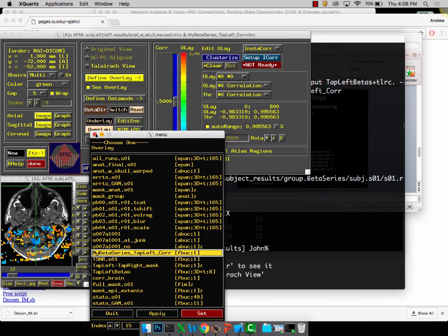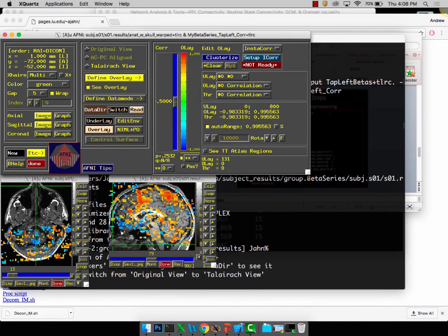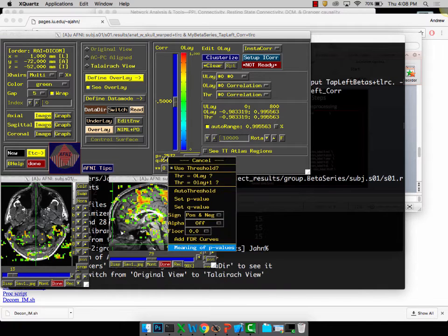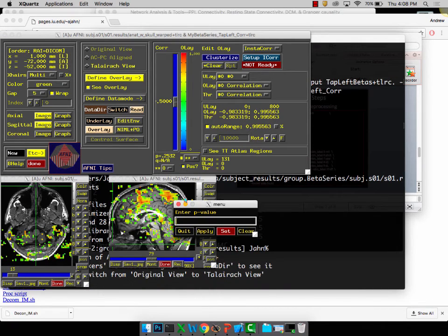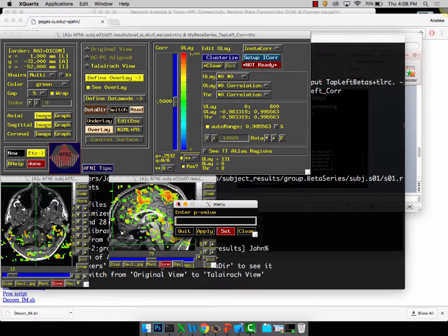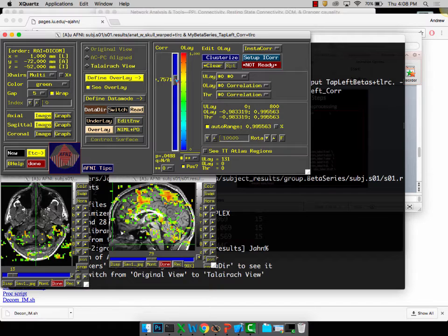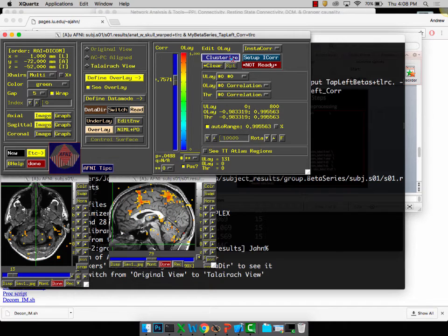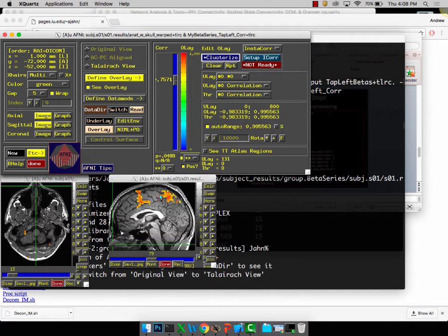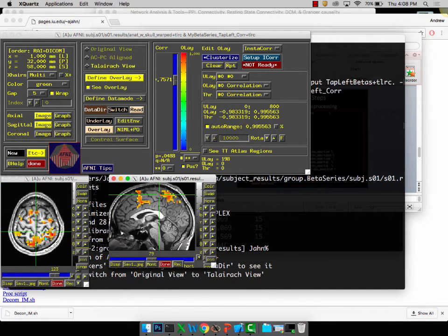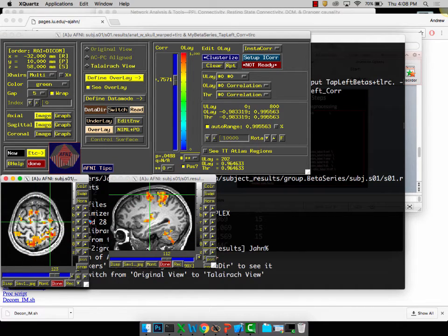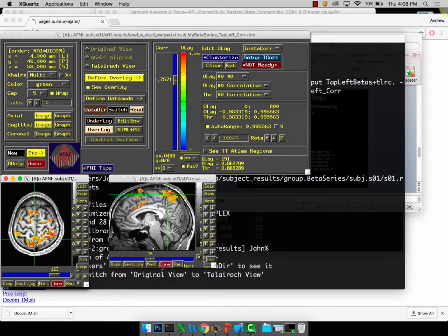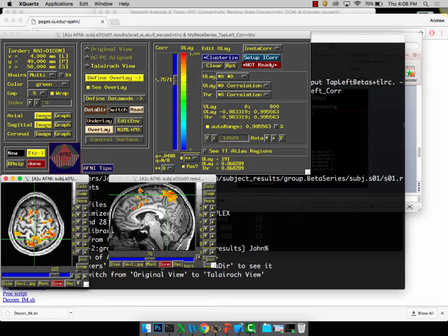If we take a look at this, remember for the univariate analysis it was pretty much just the right motor cortex that was getting activated. In this case, we want to know if there are any significant correlations between that and other parts of the brain based on these beta series. If I look at my beta series tap left correlation, here's what the map looks like. I'll threshold it a little bit to get rid of some of this noise. Let's say correlations of 0.75 or more, pretty healthy. Notice, not only within the right motor cortex, but you get a lot in the posterior parietal cortex as well.